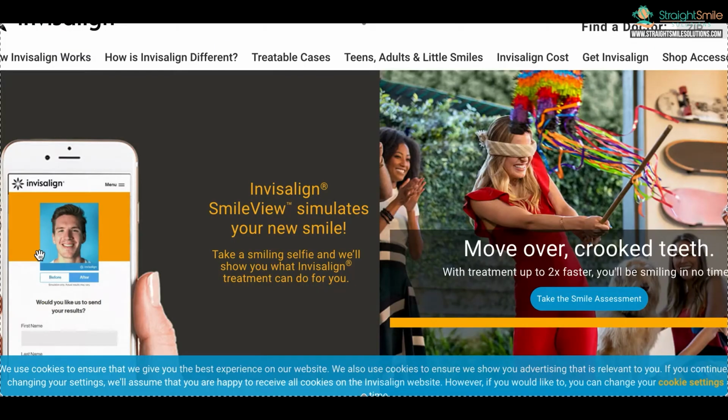Hey, it's Dr. Amanda with StraightSmile Solutions, and today I'm going to talk to you about enrolling in Invisalign Virtual Care. It's a new program. How to be a beta tester, how to get your patients involved in the virtual care app, what the benefits are, what the risks are, and just all kinds of thoughts.